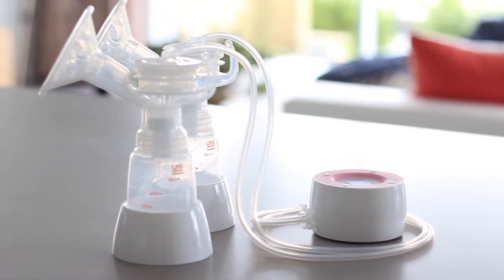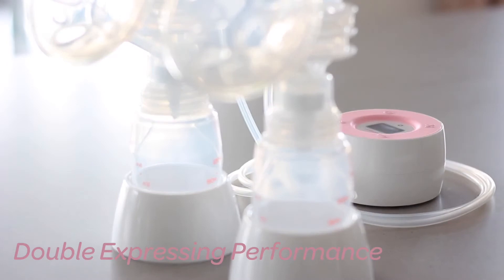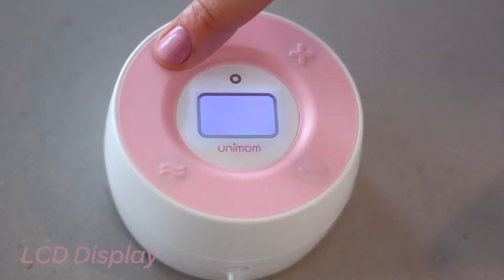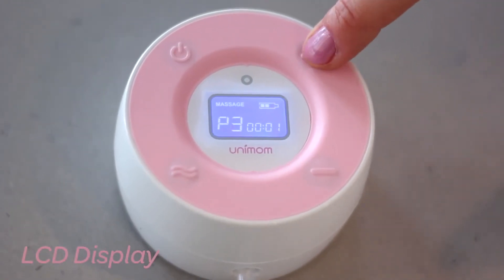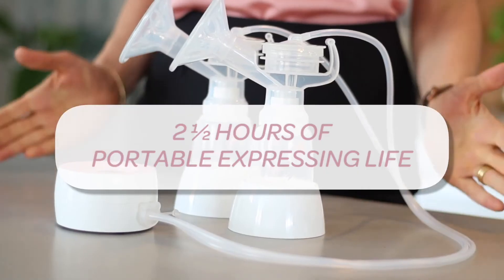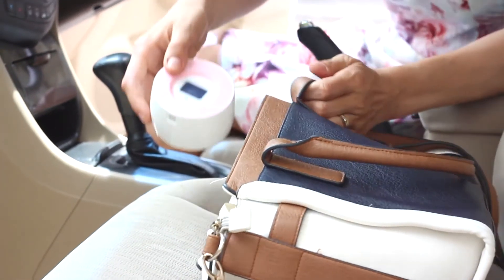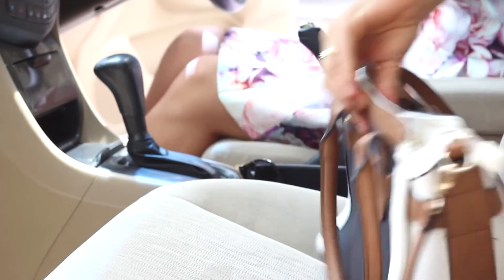This innovative, more compact design provides powerful double-expressing performance and is on-trend with an informative LCD display and USB charge port, giving you up to two and a half hours of portable expressing life once fully charged. Perfect for the working mum, and with it being only the size of your palm, you can put it in your handbag ready to go.